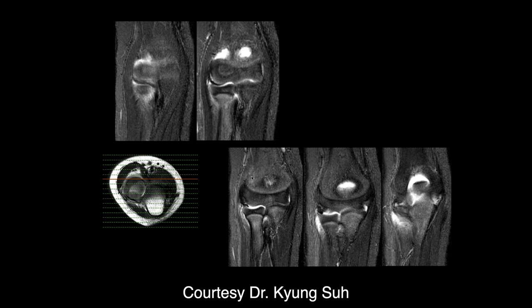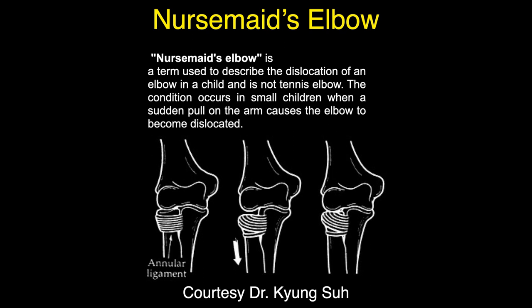I never saw it on MR. This is really an injury to the radius and the stabilizing soft tissue structures around the radial head, because it's pulled. We can see there's a lot of edema and soft tissue thickening in these structures right around the radial head, including the area where we'd see the annular ligament. And this may be a little lateral plica that's extended.